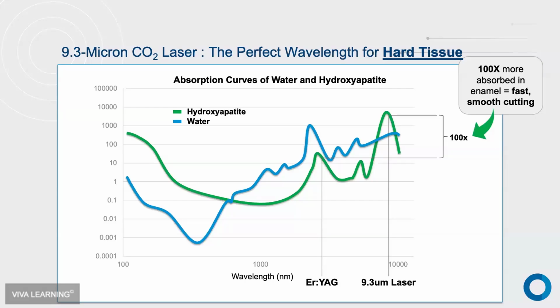So when you start to look at how some of those erbium lasers work, it's not really doing anything to the tooth structure as much as it fires a beam down, finds that water molecule on the surface of the tooth from some water spray or from the 1% to 2% of water that's in tooth structure. It ablates that water molecule and then essentially blows up that water molecule and blows chunks of tooth structure away. So it does that kind of slow and more like collateral damage.